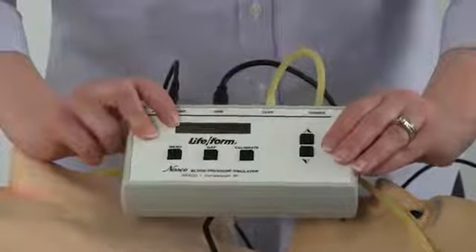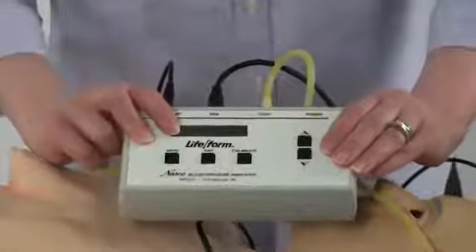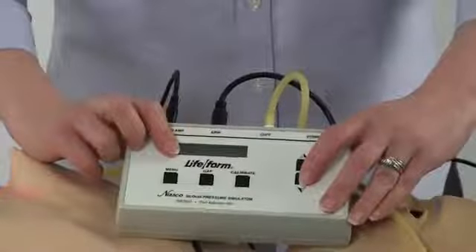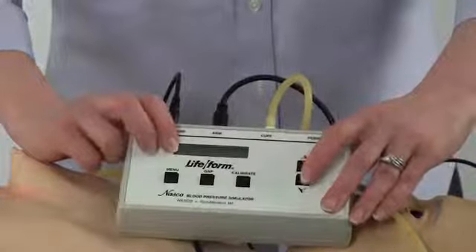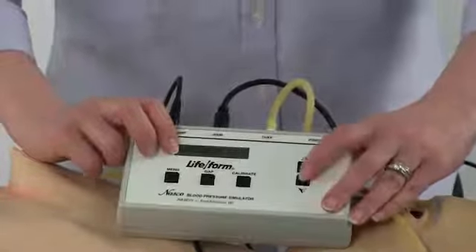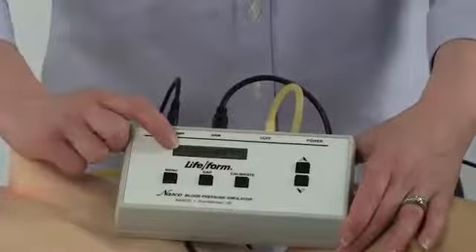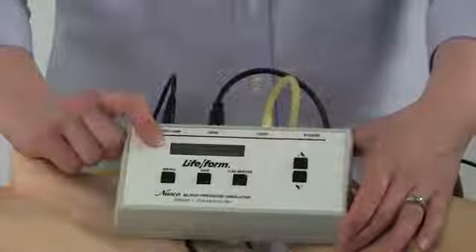Selecting the menu button a fourth time brings you to the set palpation. The pulse can either be on, or if you hit the down arrow button it will go to pulseless — this will automatically set the systolic and diastolic pressures both to zero. Selecting the menu button for a fifth time will bring you back to the home screen on the electronics control box.